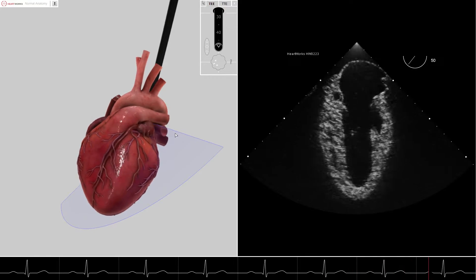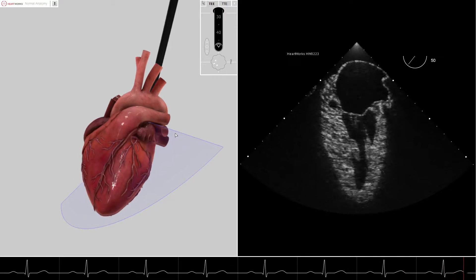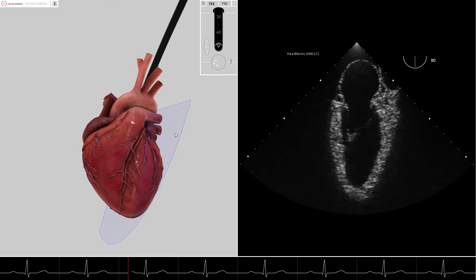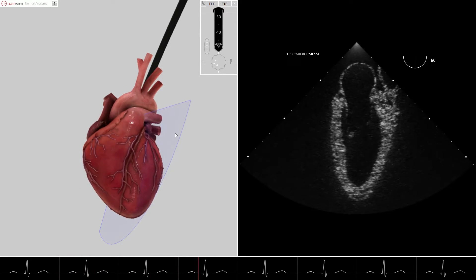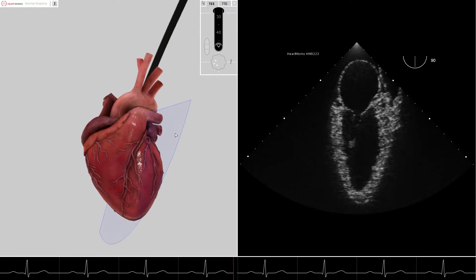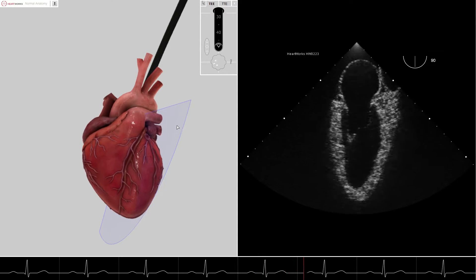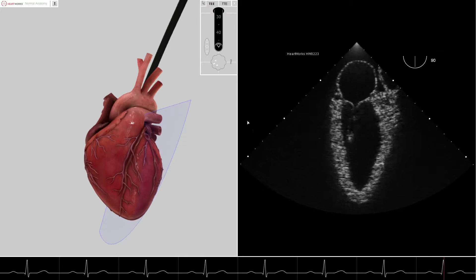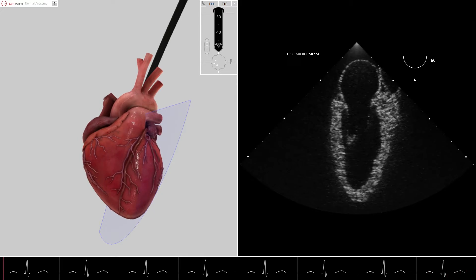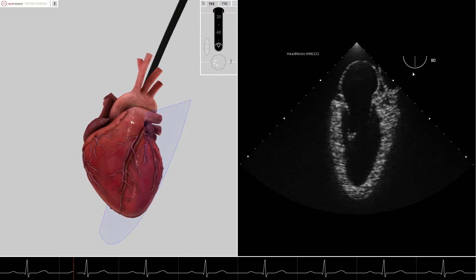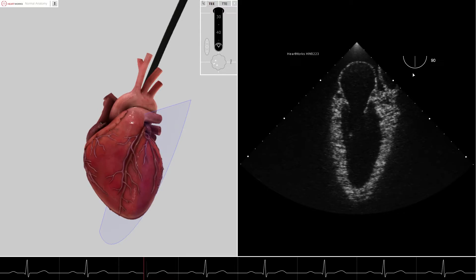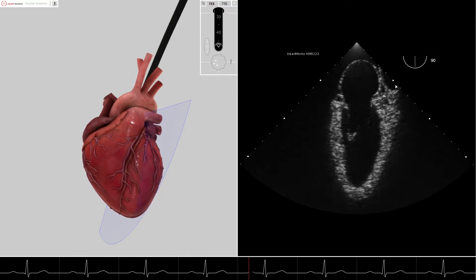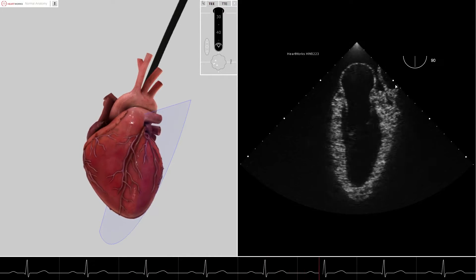In the next image, we will advance the omniplane to 90 degrees. In this image, the marker side of the cut plane still represents the marker side of the true ultrasound image. But now, the marker side of the cut plane has moved further anterior to the true anterior wall of the left ventricle.